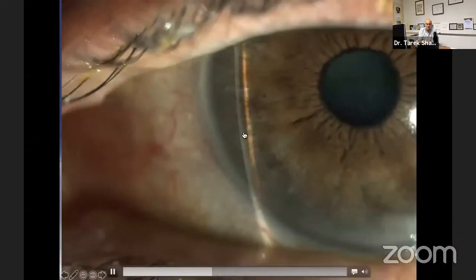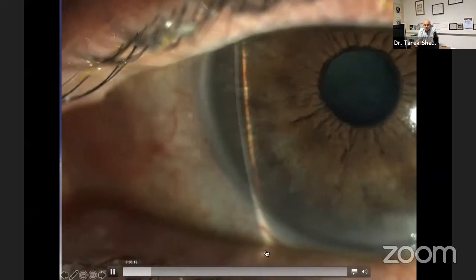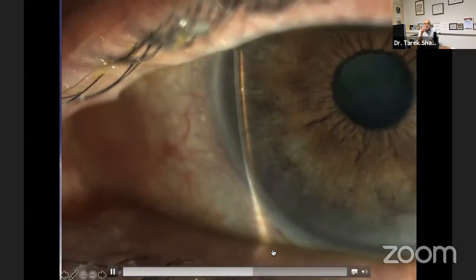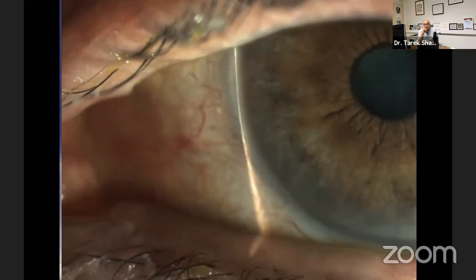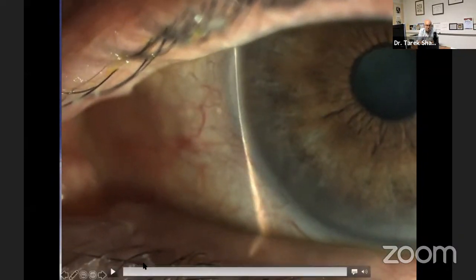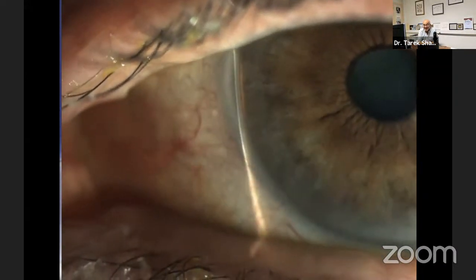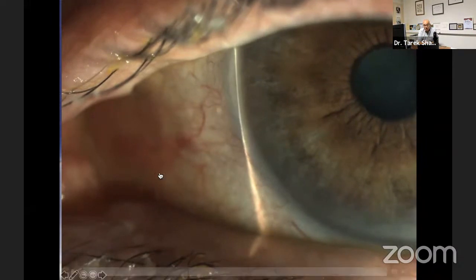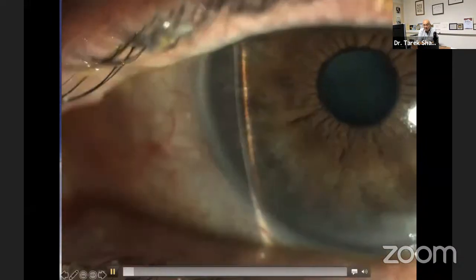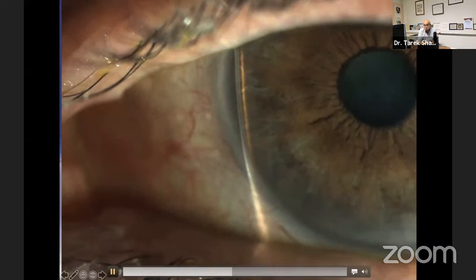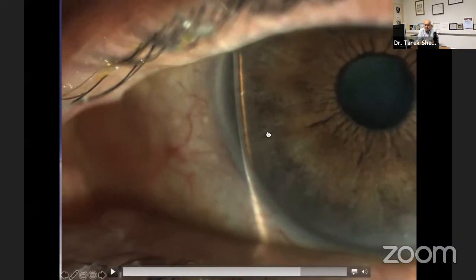Gonioscopy is of absolute importance, but don't forget that we can do simple tests prior to gonioscopy that can be helpful. Here you see the Van Herick test, a very simple test to find if there is a high chance of the angle being closed or open. We look at the thickness of the cornea and compare it with the depth of the anterior chamber in the periphery.